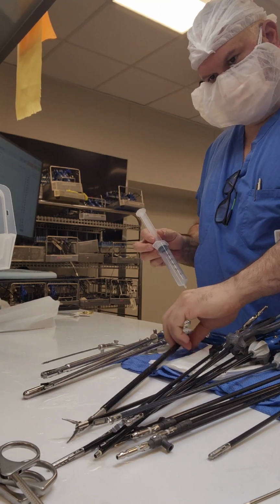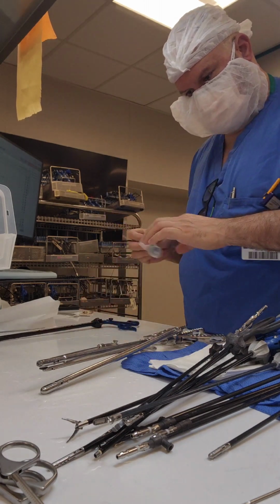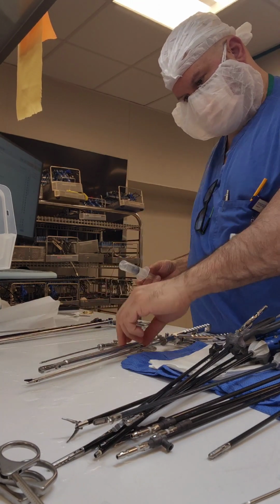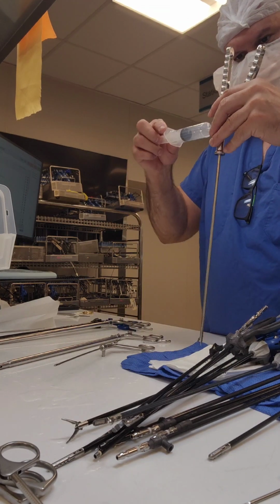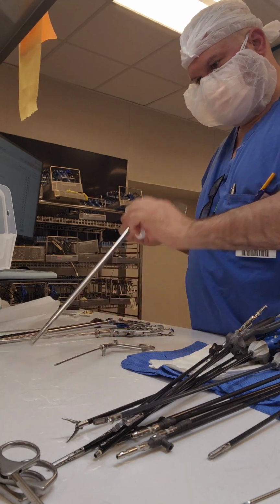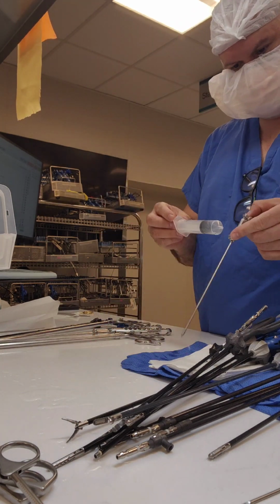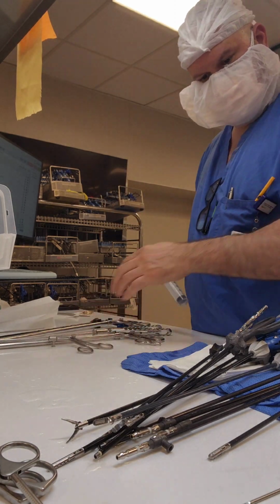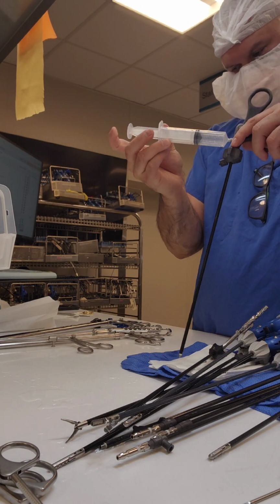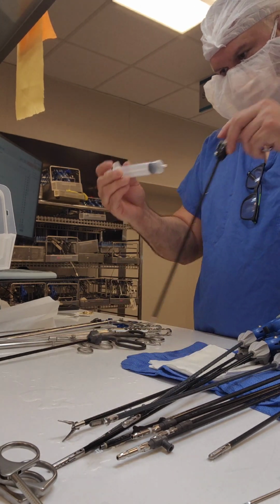So now I'm just injecting air into all of my instruments to get as much residual water out of them. Again, I don't use much water, so a nice little air flush should get most of the water out of there. If there's a little bit of water in there, I'm not really concerned about that. Now, some people argue with me about that and say the instruments need to be dry. I get it, and I completely understand that argument. It's just I haven't seen the data showing that having a little bit of water in your instruments is going to hinder the process, right?